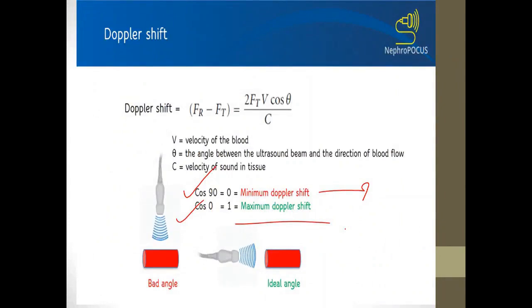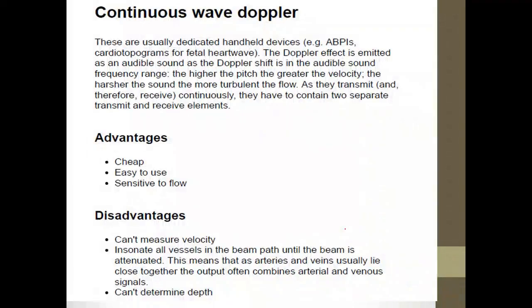If we remember, I mentioned a case related to continuous wave Doppler. I said that if I want to detect the motion of an object moving at a very high speed, in the case of pulsed wave Doppler, where I send a pulse and wait to receive it, then the speed of that object could be faster than sending the pulse and receiving it.